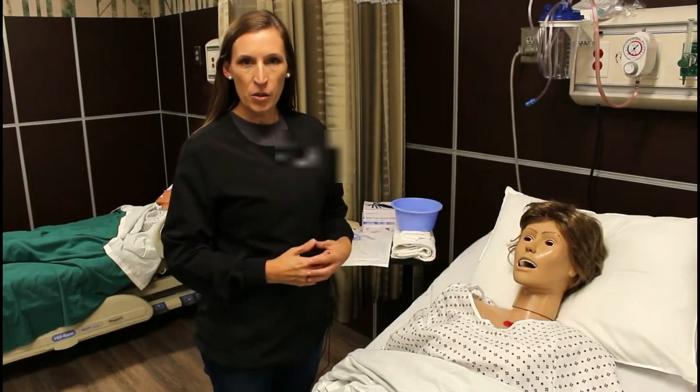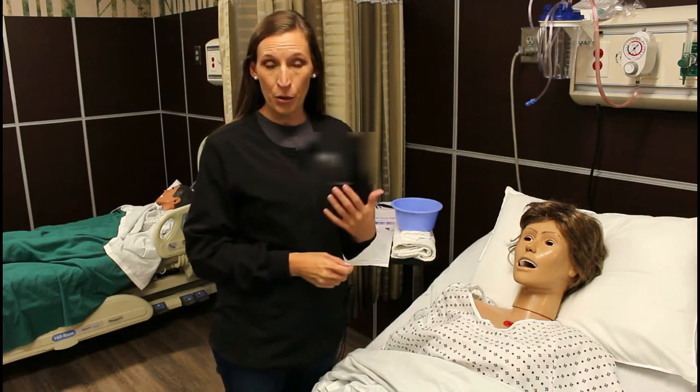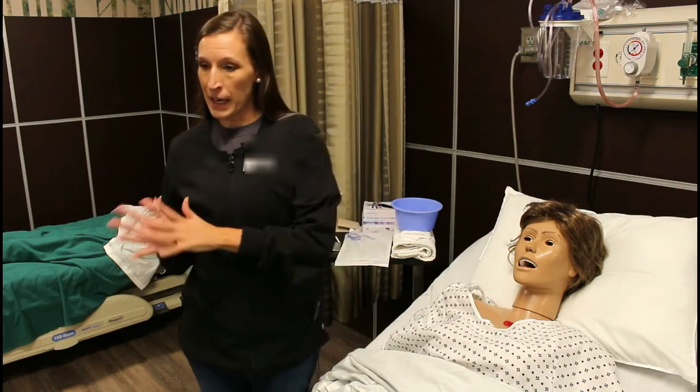The first thing we're going to do is check our order and verify that it's correct. We're going to gather our supplies and enter the room. Knock, wash my hands.